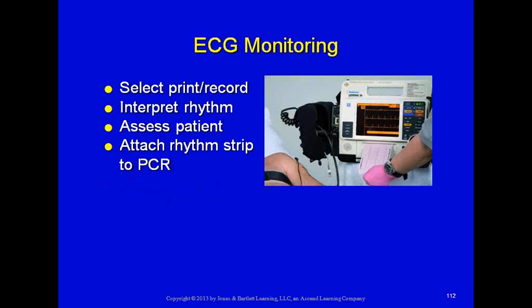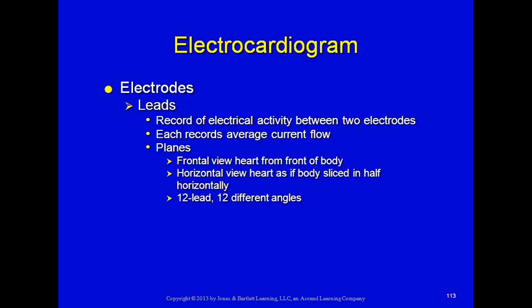And then once you run a strip, there's a variety of ways now that those strips are being attached to the patient care record or the patient care report. Some are being Bluetoothed and electronically uploaded to software that you write your patient care report in. Others are still printing them out, taping them on paper, and scanning them in, or just putting the paper version in the patient care report.